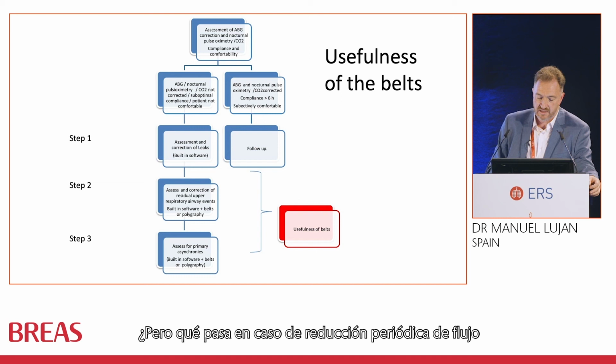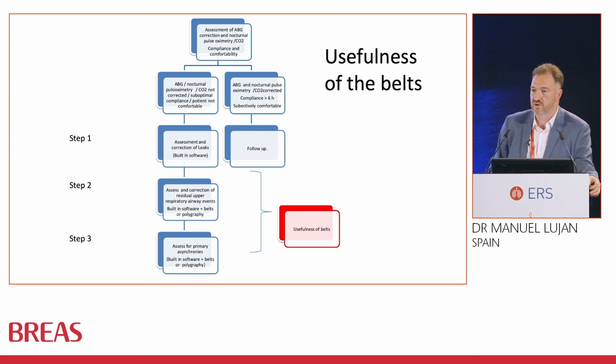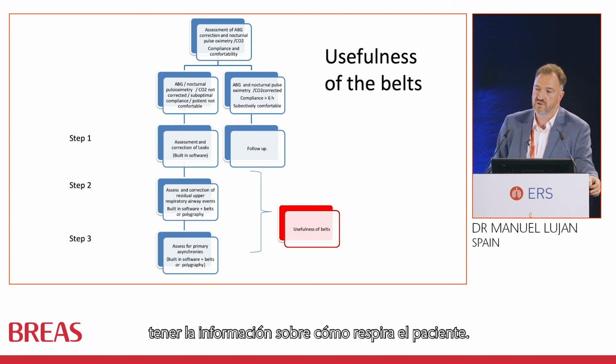But what happens in case of periodic flow reduction or asynchronies? In these two situations, it would be important to have the information about how the patient is breathing.